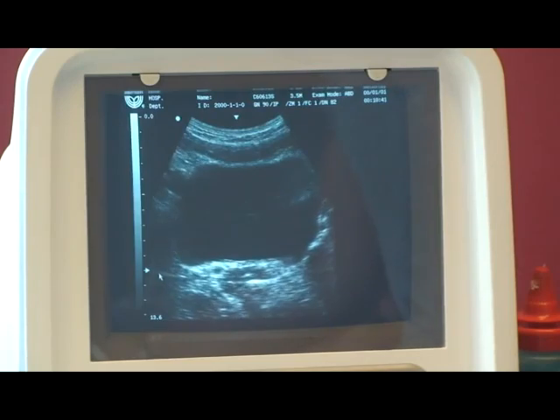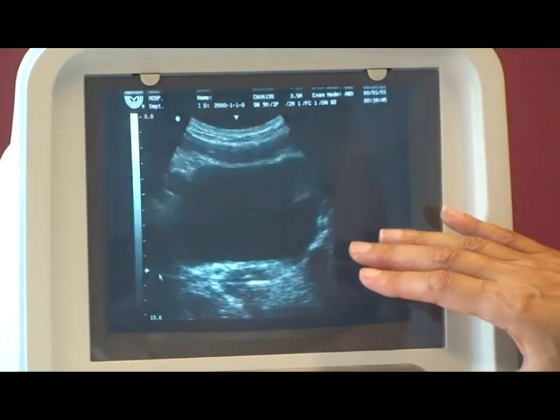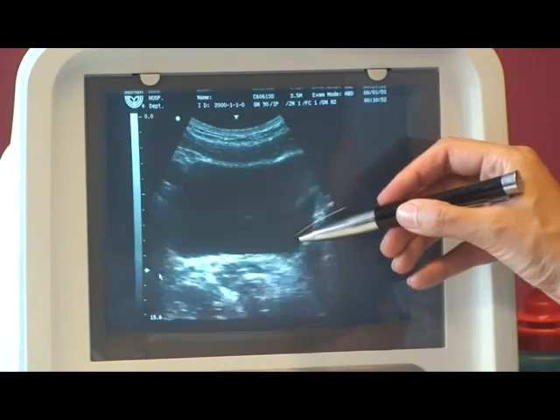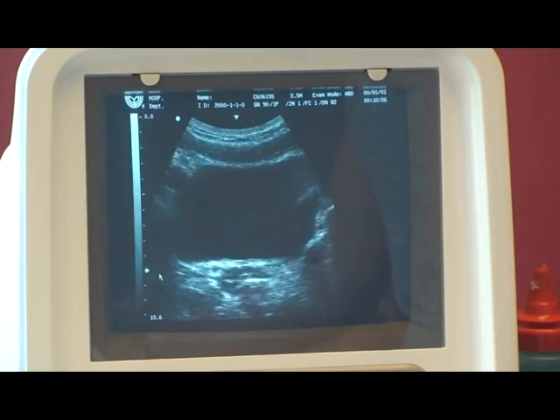From here, what we're going to do is observe what happens with breathing. As Penny breathes in, the pelvic floor goes down, and as she breathes out, the pelvic floor goes up. That's what you want to check for first, and that's normal.